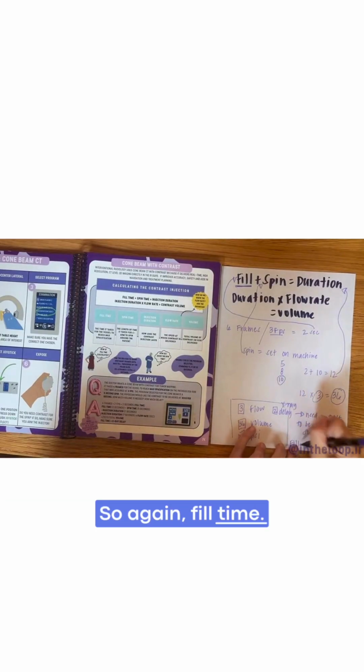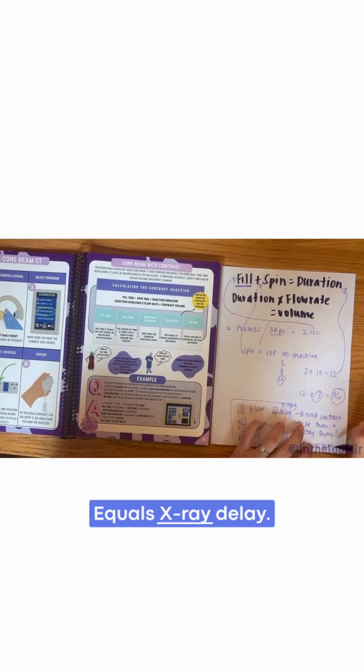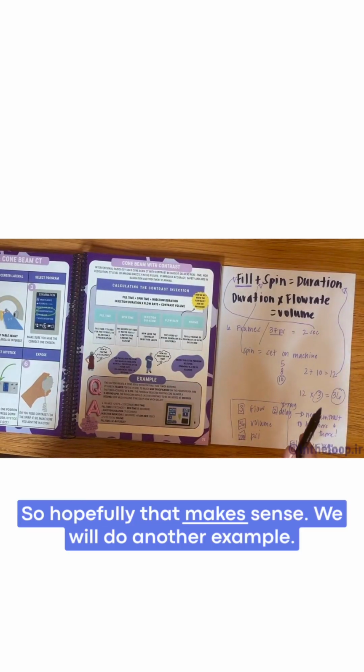So again, fill time equals X-ray delay. Hopefully that makes sense. We will do another example.